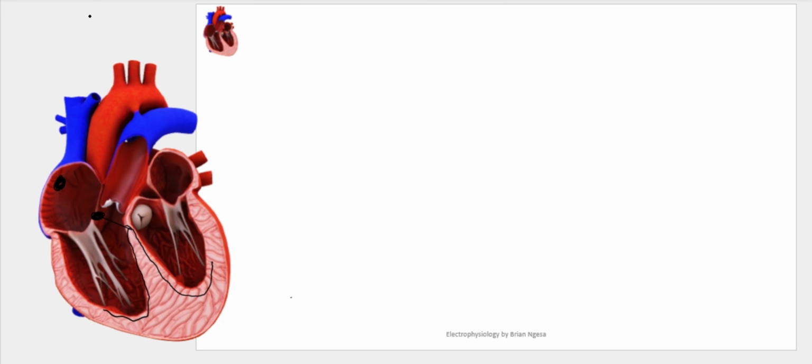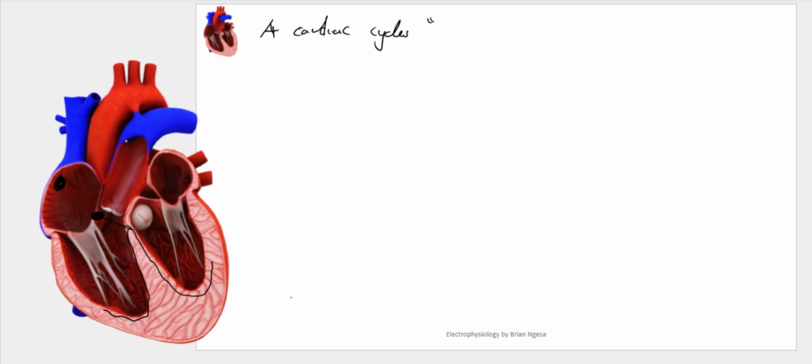So for example, in our ECG, we are still in reference to what we suggested while beginning our lesson, the cardiac cycle. So the events that happen between one heartbeat to the next heartbeat. So more specifically, the electrical events. So this is what the ECG seeks to establish.